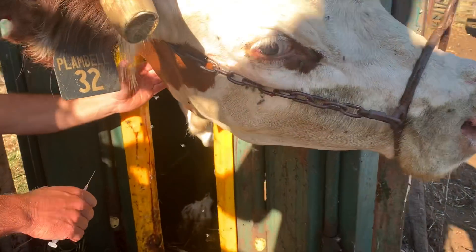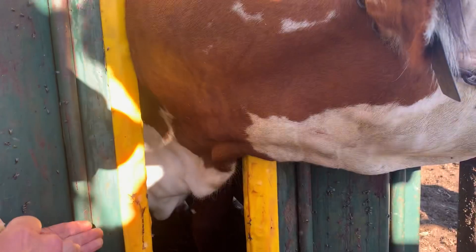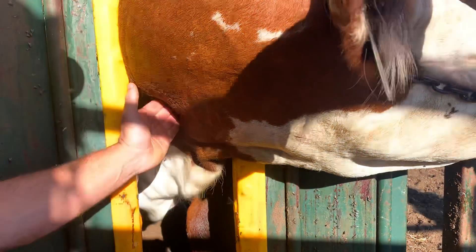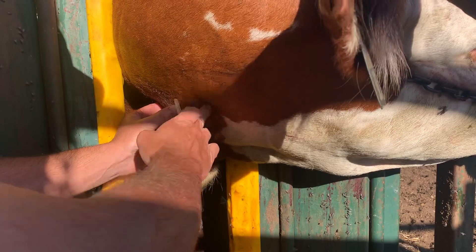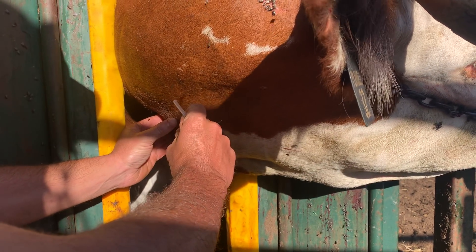The jugular is in that furrow. Make it big — can you see it big? Watch it fall. Can you do it? Ready? Hold off. Tram it down. Transverse. Right through. Pull back to get a flash of blood. Pull, give half. Pull back. Give the rest. Pull back.